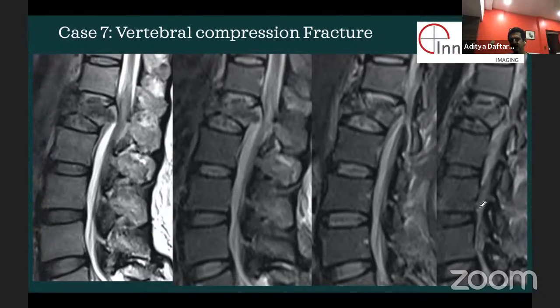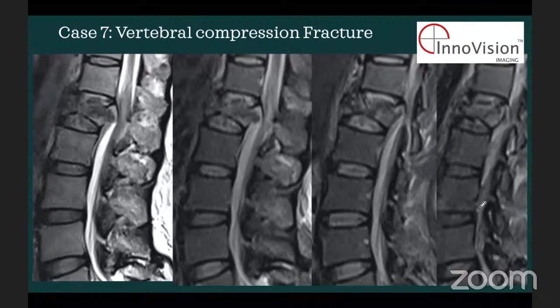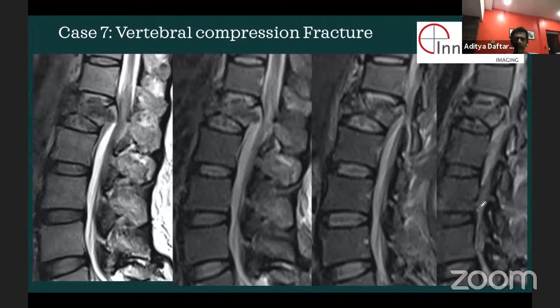You can give contrast anytime. Even on day one, we give contrast. So ideally, post-op immediately, if you want to get a scan, a contrast scan would be better. Ideally, the time to do a scan and to give contrast is when you're trying to make a decision on whether you should operate or not operate. So if you tell me that you want to wait 3 months and then take a decision on whether to operate or not, you do it around that time. You tell me it's day one, the patient has excruciating pain, I need to know if it's disc versus something else, then you do it on day one.